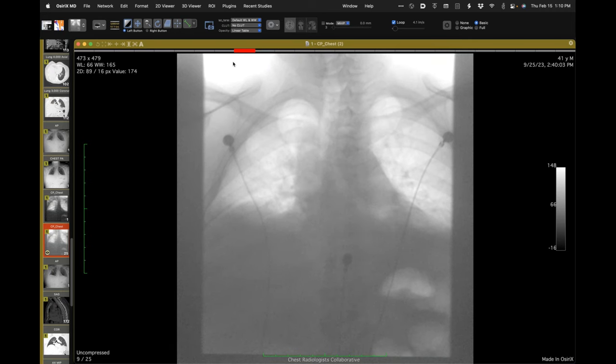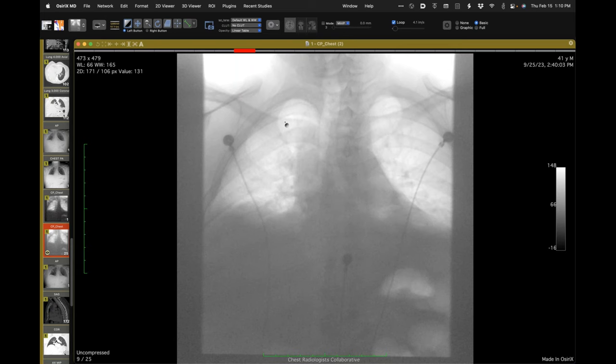One potential substantial pitfall when looking for hemi-diaphragm motion, particularly bilateral, is the problem of relative motion. Patients will use accessory muscles of respiration — the scalenes, the intercostal muscles — to try to inflate the ribcage. So the ribcage will move, and the question is whether the hemi-diaphragms are actually moving or just appearing to move.